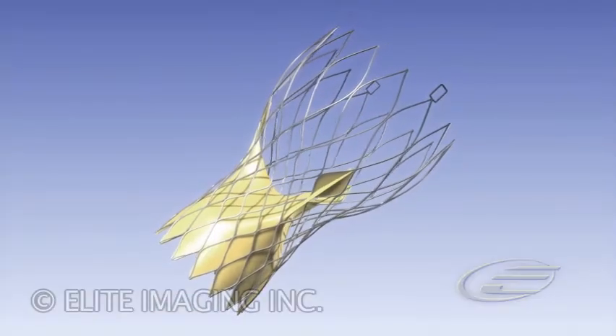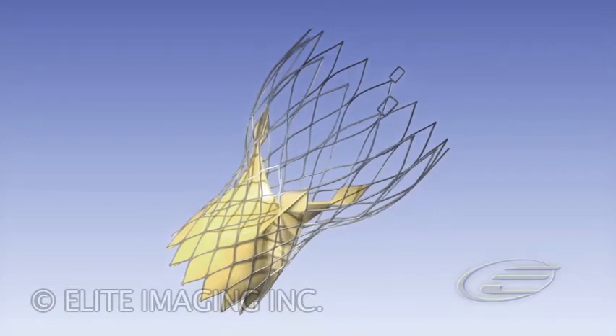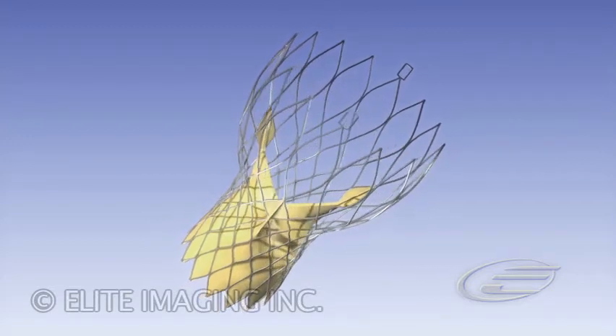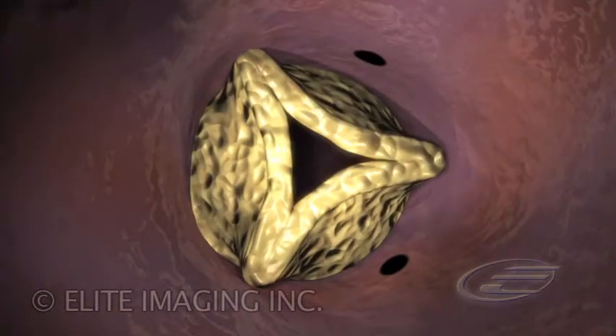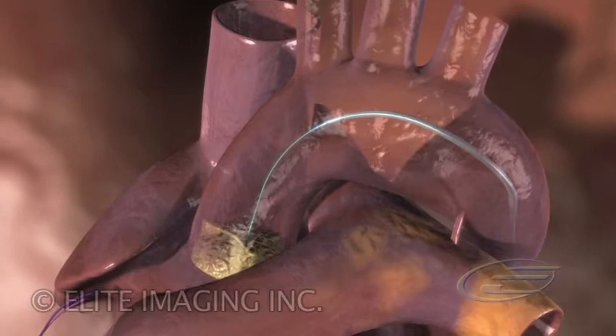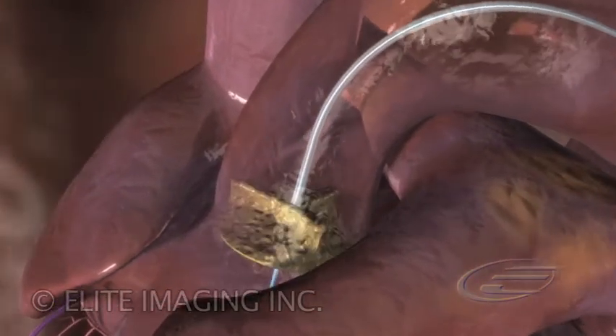The self-expanding nitinol multilevel frame containing a tri-leaflet porcine pericardial tissue prosthesis is specifically designed for retrograde percutaneous implantation via a specialized catheter. Using familiar interventional deployment techniques, this device ensures precise positioning and secure anchoring.